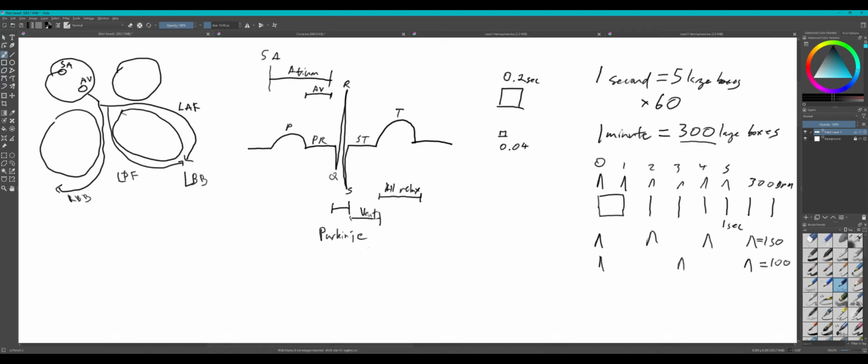All right. Now what's 1, 2, 3, 4? How much would that be? What's 300 divided by 4? You guys said it earlier. 75. There we go. And then 1, 2, 3, 4, 5. It's 300 divided by 5. 60.